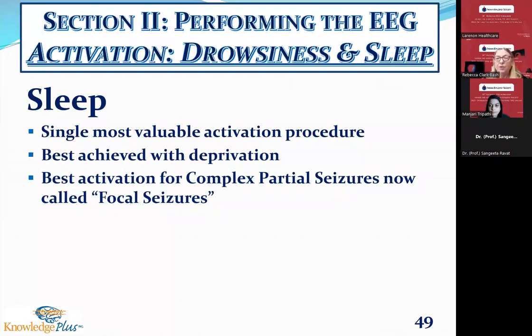Now, the other thing I like to do is I like to have some kind of sound masking device so that the patient doesn't hear any noise outside of my EEG room. We had 7 EEG rooms. The floor was tile. So if anybody walked down that hallway, it would wake our patients up. So if you just have some nice music, classical is very nice. You can even use Pandora on your phone or some Spotify to play some music at a tone louder than you normally would to mask all of the noise outside of that EEG room.